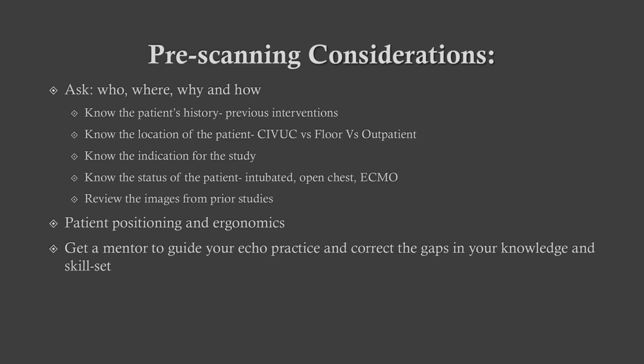Before heading to the patient's bedside, you need to ask yourself a few questions. Who am I going to take care of? Where? Why? And how? Know the patient's medical history, whether the patient had previous interventions or procedures. Location of the patient in the hospital.